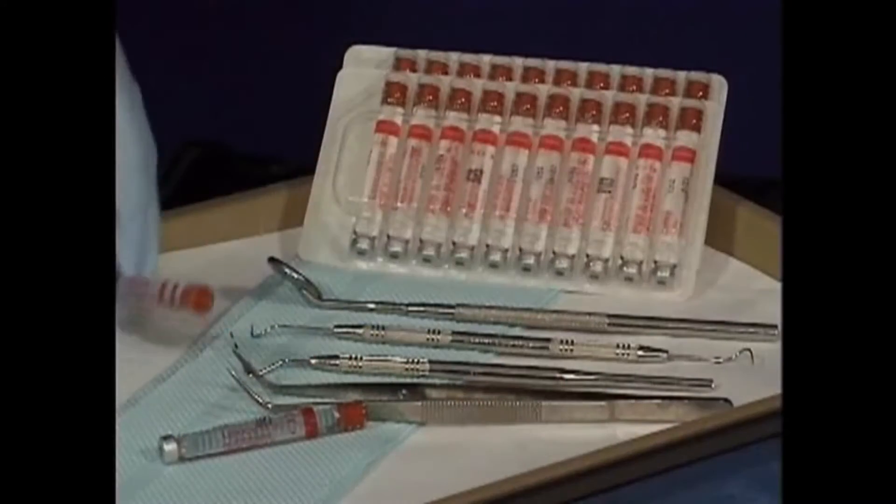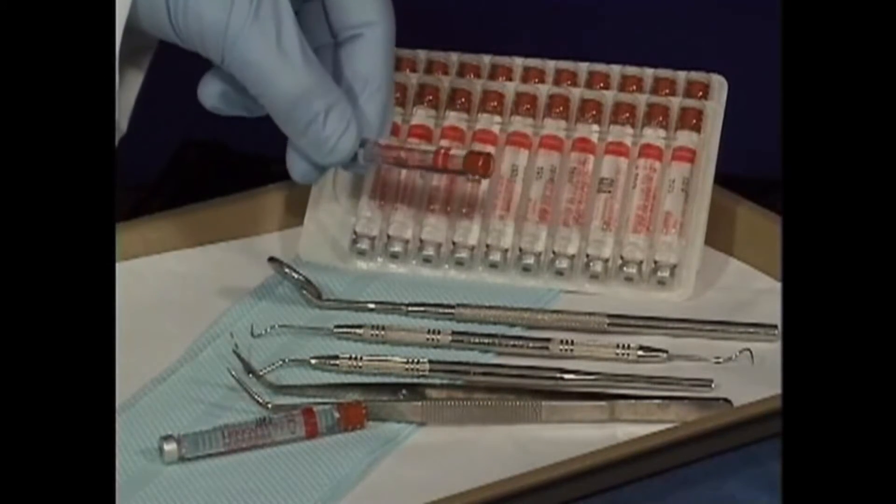For the surgical placement of the implant, your mouth will be numbed. An incision is made in your gums and a channel is made in the bone to receive the implant. After the implant is snugly in place, the gums are closed over the implant with a stitch or two.